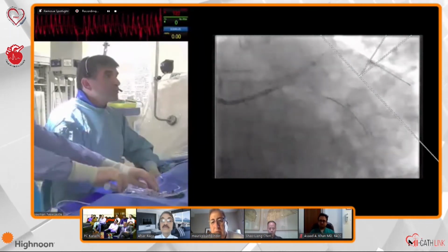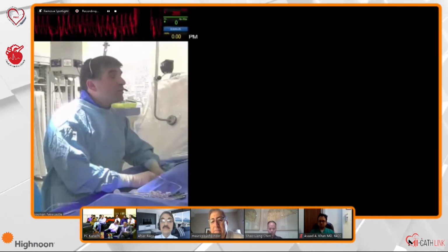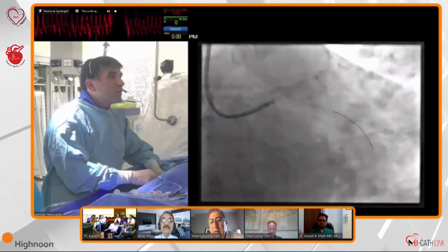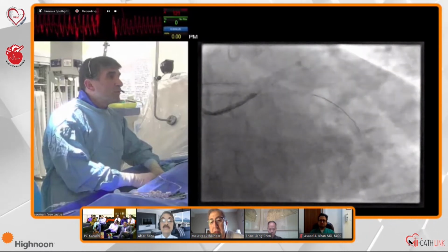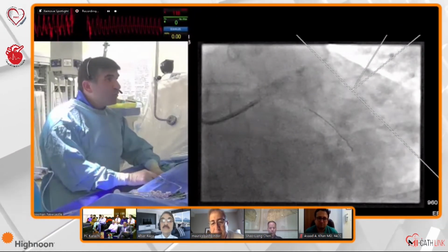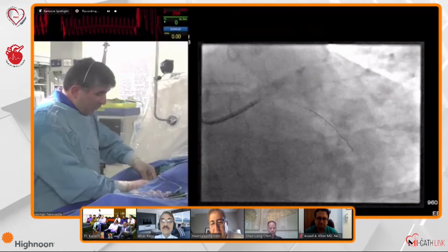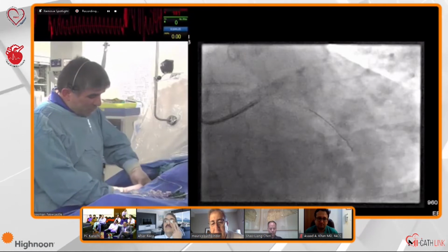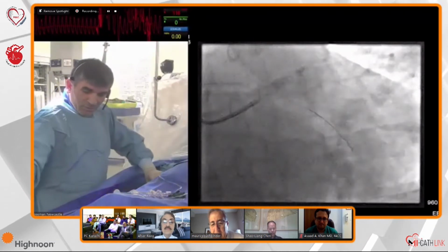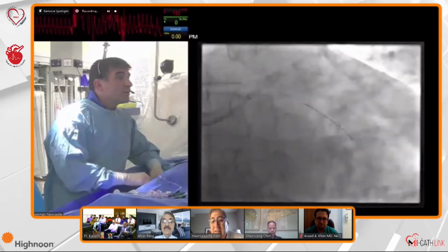Okay, a little test. Oh, well, that's okay. Right there. No, just one second. I'll put that back on again. Oops, that's my wire being a bit, because you go to high pressure. I found this with the Cyan Blue. I don't know if you have the same experience, anybody? Yes, where you go to higher pressure, the Cyan Blue just gets stuck. And if you're not paying attention, it comes back. Particularly with the particular kind of wire of balloons. But I don't understand that phenomenon. Apparently, it's got to do something with the coating. But anyway, that's not an issue here. The LAD is open and we're okay here.